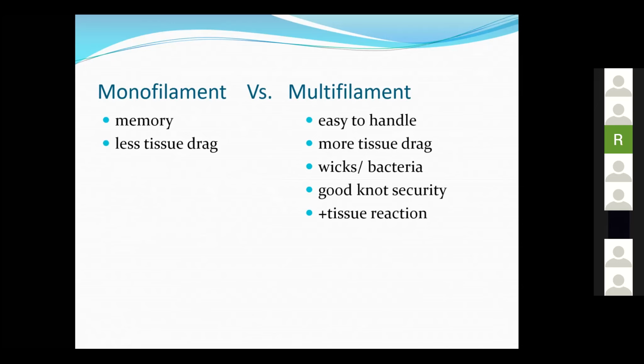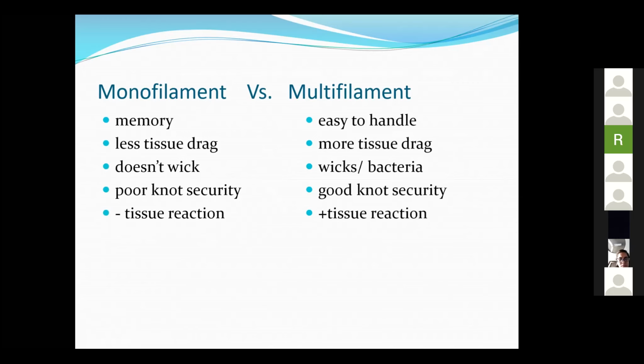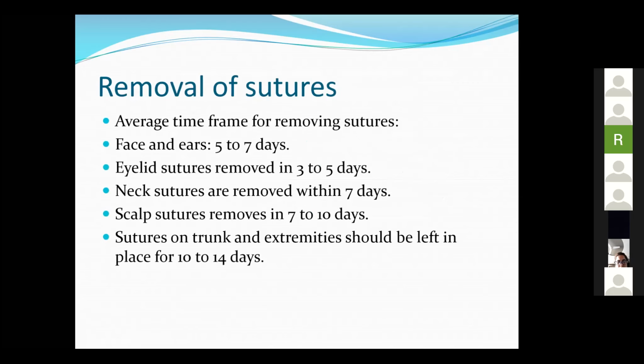Monofilament passes through the tissues easily. It does not harbor bacteria. The knot security is not very good, and it has almost negligible tissue reaction. So we have to select where we are using monofilament versus multifilament.